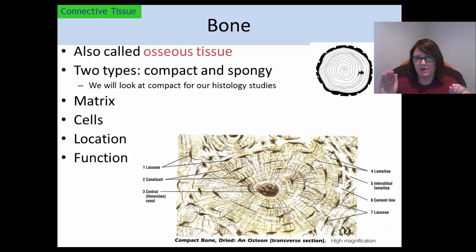We often don't think about our bones being flexible, and I'm not saying you should attempt to see how well they flex, but there is some flexibility to bone due to the collagen component. The calcium phosphate crystals, the hydroxyapatite crystals, give bone its strength.